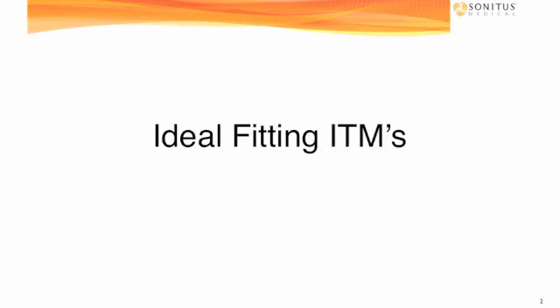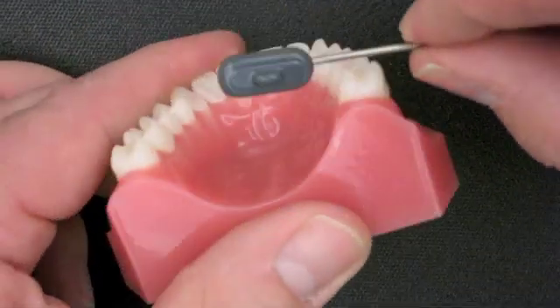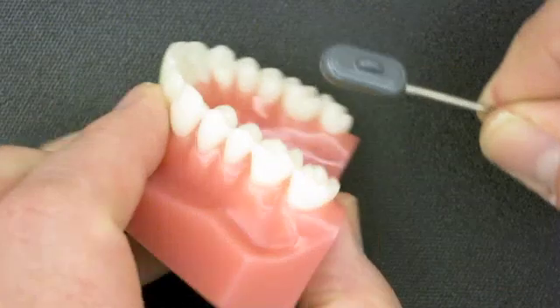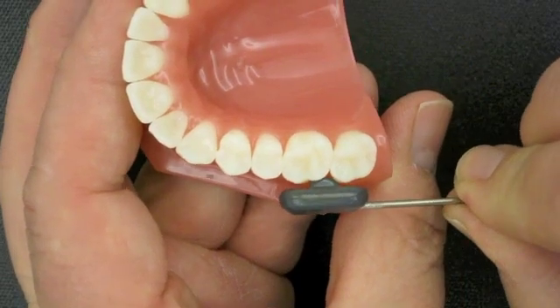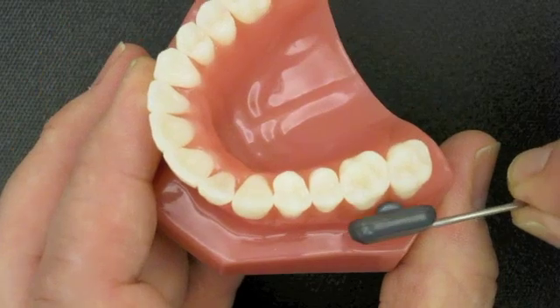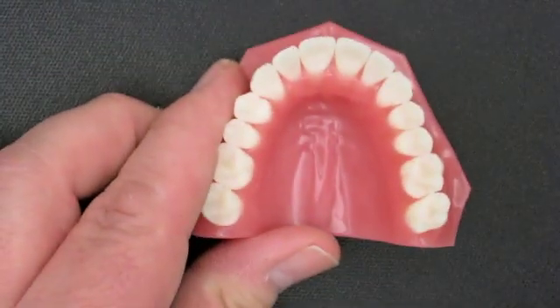Let's first look at ideal fitting ITMs and parts of the ITM, the part that goes in the mouth. What you see here is an actuator. The actuator is what imparts the sound to the teeth, and you'll see it fits a certain way onto the teeth. There's a little M&M-like nub on it that has to always touch two teeth, as you see here. It can't be too high or too low on the teeth. We don't want it interfering with the gums. We want it to fit nice and tight on two abutment teeth for the SoundBite system.